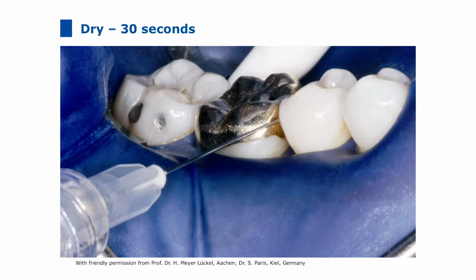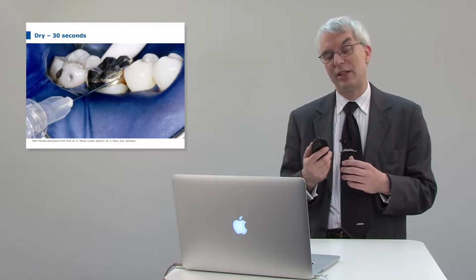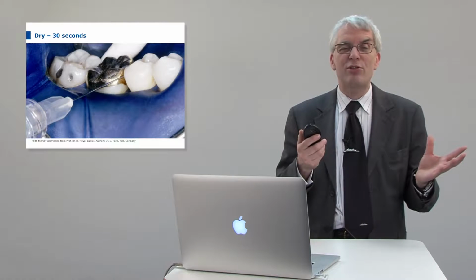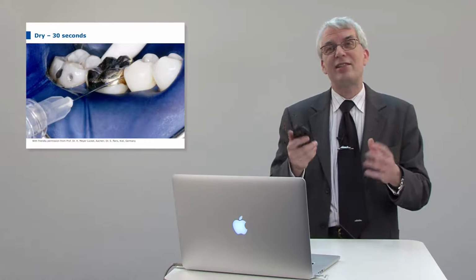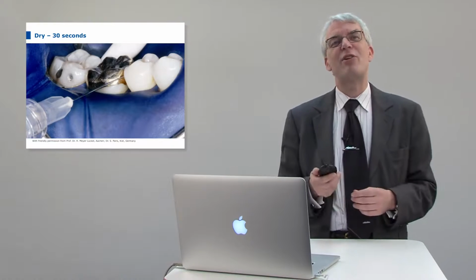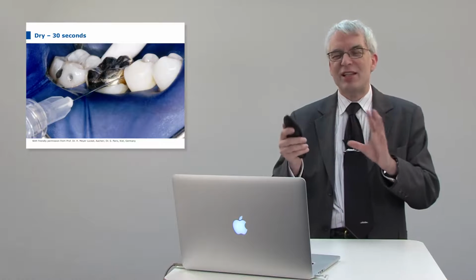And now it's time to dry. And the drying process will be done with very high purity alcohol. This is 99% pure drinking alcohol. So if you do a lot of Icon treatments and you don't use up all the Icon Dry, you can collect it, and at the end of the year you can have a big office party with cocktails for everyone. Now, seriously, this is an important step. So dry the lesion with the alcohol for 30 seconds and then air dry.